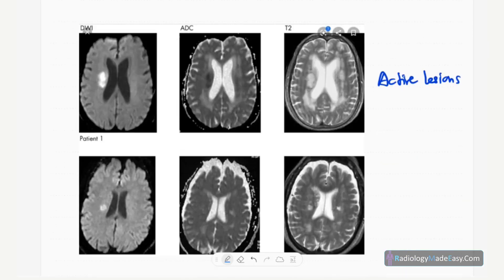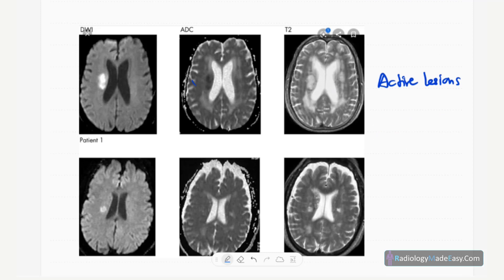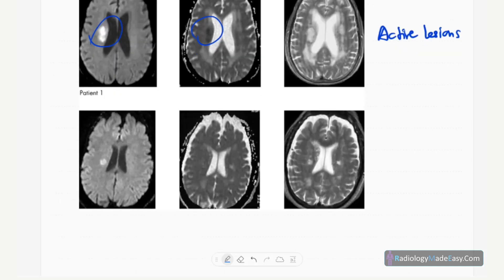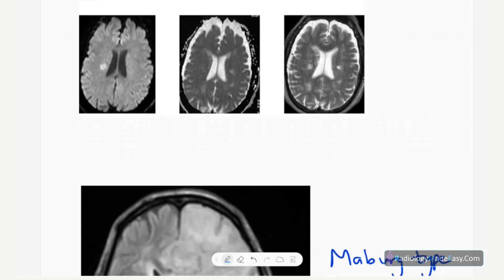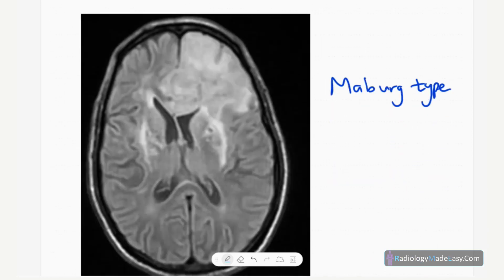In active lesions, you can see diffusion restriction — DWI shows high signal and ADC shows low signal areas. So there is diffusion restriction in active lesions, along with enhancement.